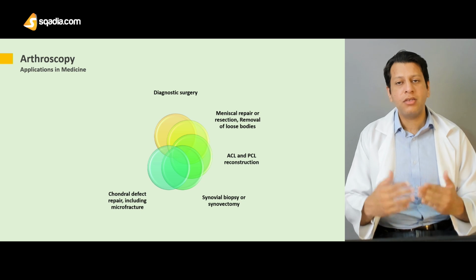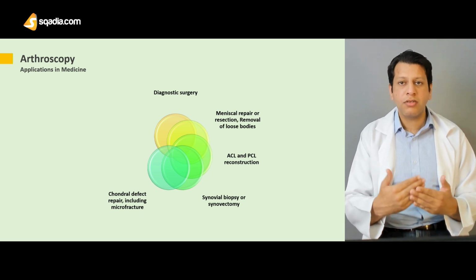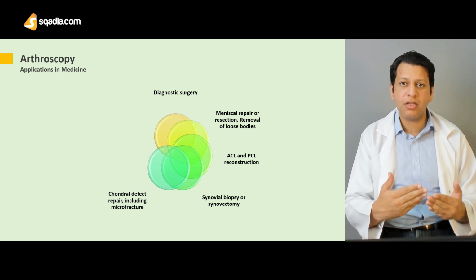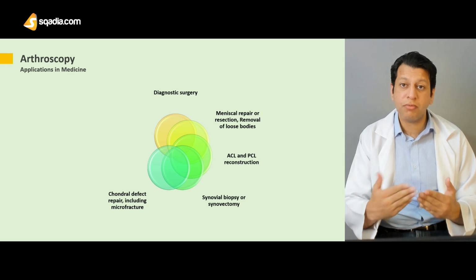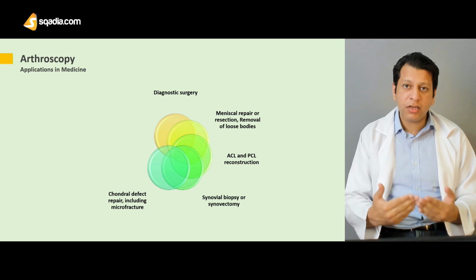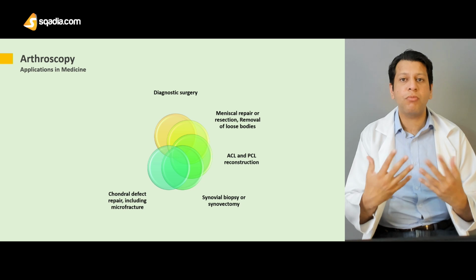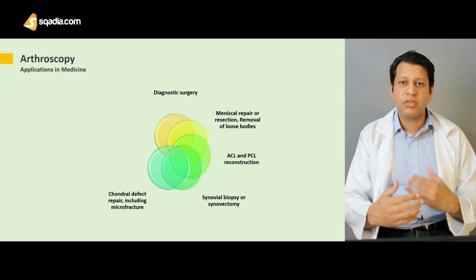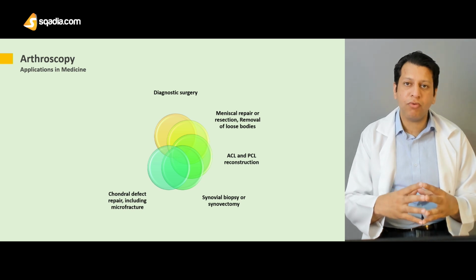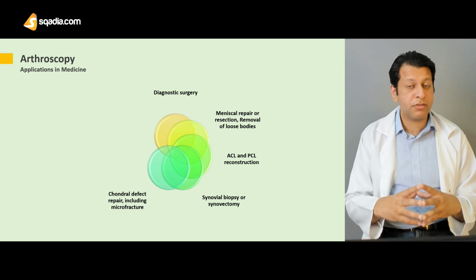One technique is that you go in with an arthroscope and use retrograde drilling techniques to go from this bare area in the cartilage from outside towards inside, towards the femoral medullary cavity. Once the medullary cavity contains those pluripotent stem cells, they come and lie over there, and they form a fibrocartilage over the top of it. So this is a technique of microfracture, in which multiple microfractures are formed at that bare area where the cartilage loss is present.